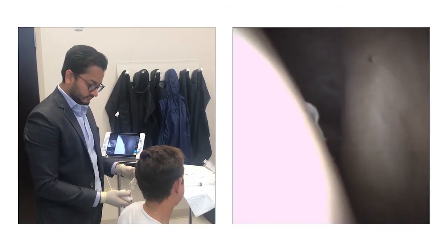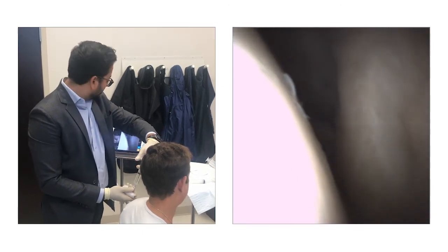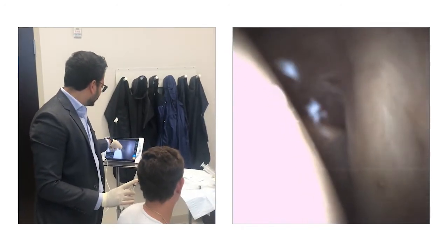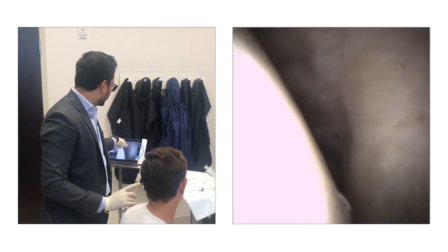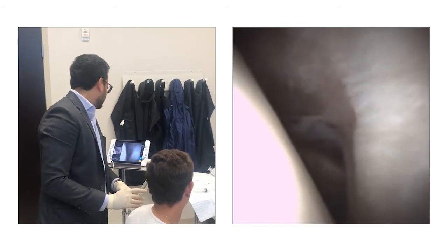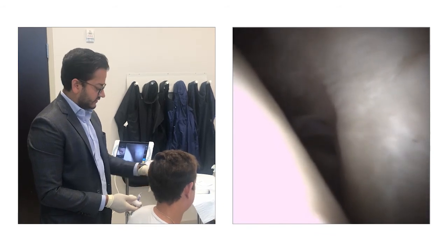Do you see any adhesions in this shoulder as you did in the right? No, not as bad, but your capsule is definitely inflamed — it's red. If you look right in here, that's red tinted. This is your subscap, which is a rotator cuff muscle. The ball, the socket, the labrum. And you get your biceps here. There's a reddish tint — nothing unusual. That's what is expected from a frozen shoulder.